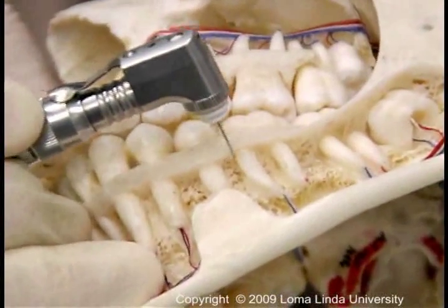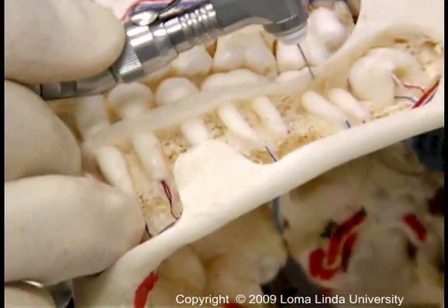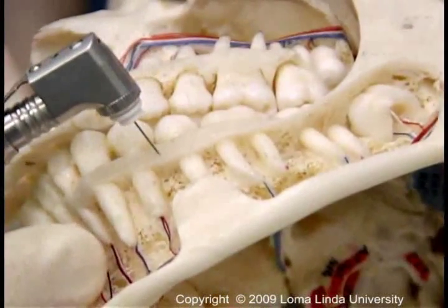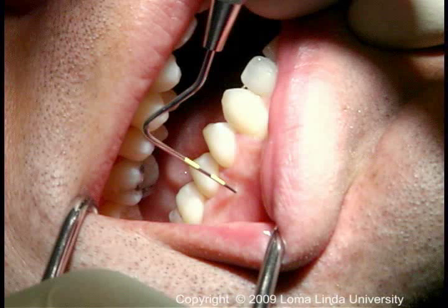Note that on the mandible, the cortical bone is dense and it increases in thickness to the posterior. This is why the posterior mandible is difficult to penetrate with the perforator. This shows the location of penetration, which is in the interradicular space with the attached gingiva slightly apical to the cervical margins of the crowns.